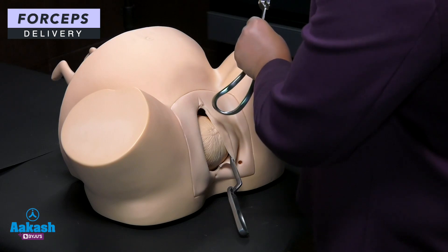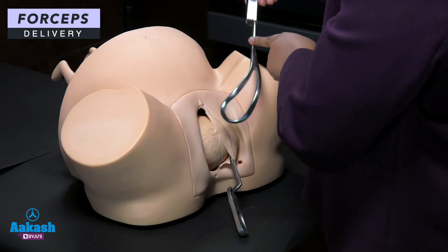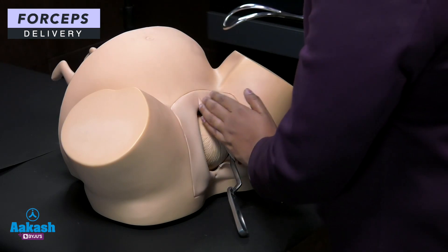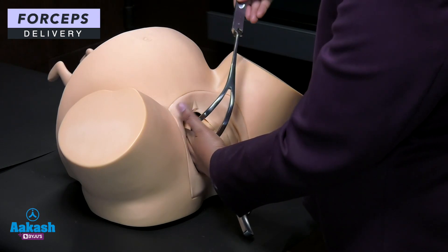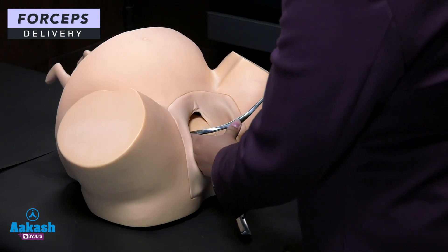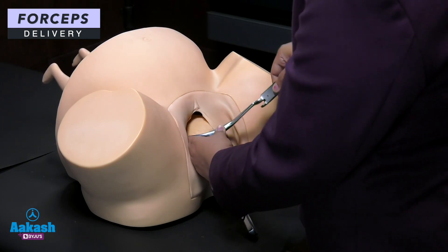Now insert the right blade. Similarly, the right blade is held parallel to the inguinal ligament of the left thigh. Insert your hand again to guard the maternal pelvis and guide the forcep inside, with your thumb at the junction of the shank and blade.